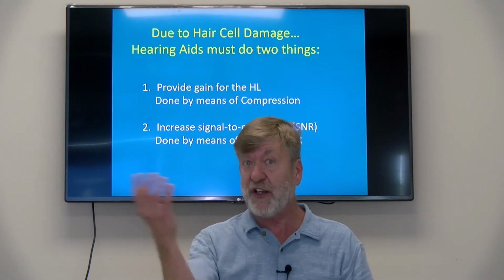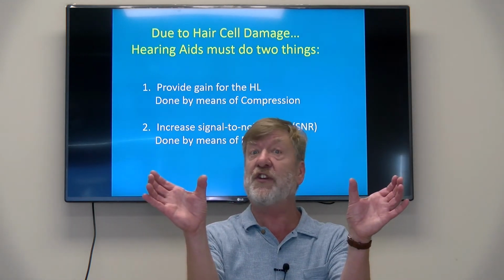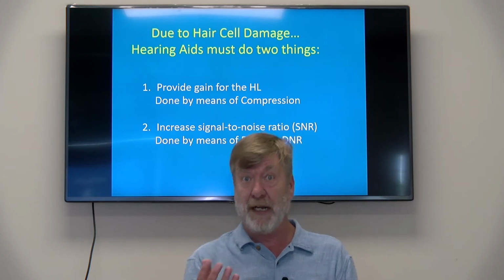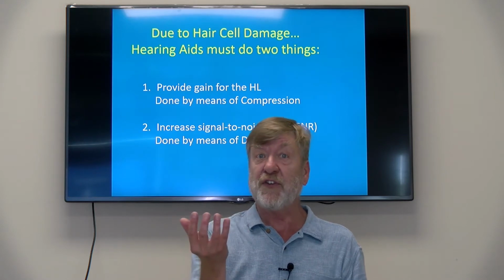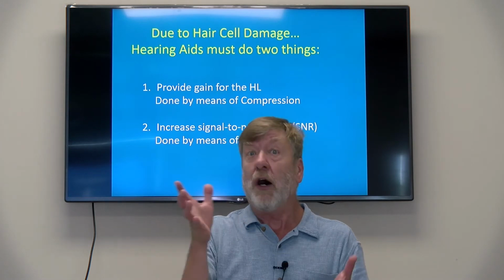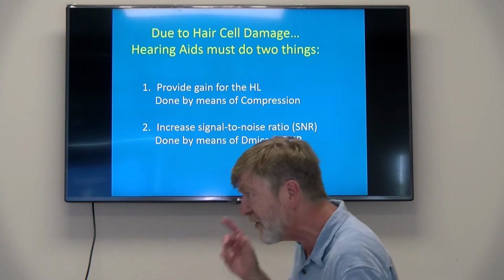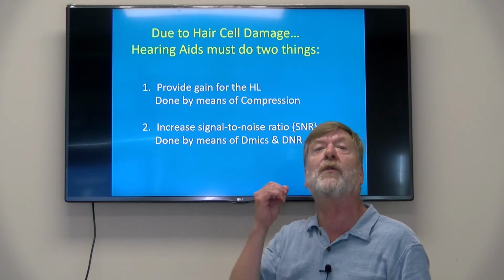Let's say the speech is 60 decibels and the noise is 60 decibels. Well, that's even Steven, so that's a 0 decibel signal-to-noise ratio. Let's say the speech is 60 and the noise is 70. That's a minus 10 decibel signal to noise ratio. Let's say the speech is 60 and the noise is 50. Well, that's a plus 10 signal to noise ratio. Obviously, the better the signal to noise ratio, the easier it is for the person to listen to speech and noise. So hearing aids have to deal with that because the biggest complaint of hearing aid wearers is background noise.